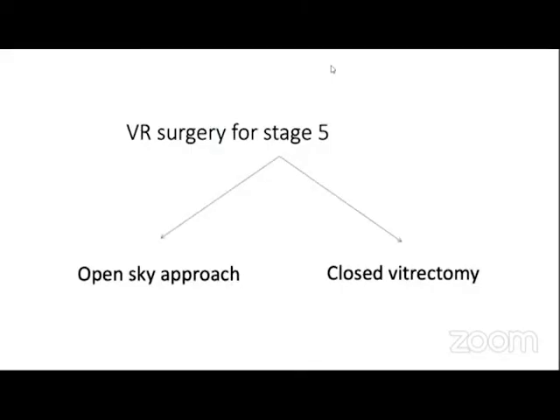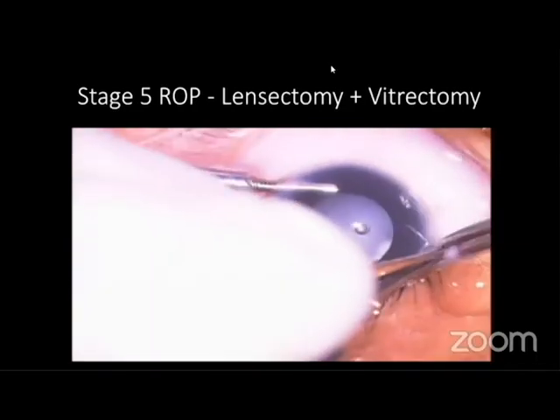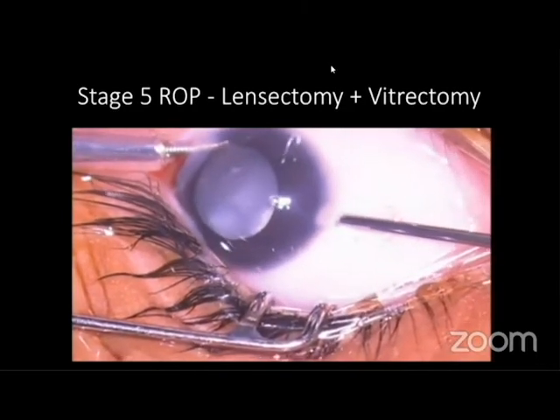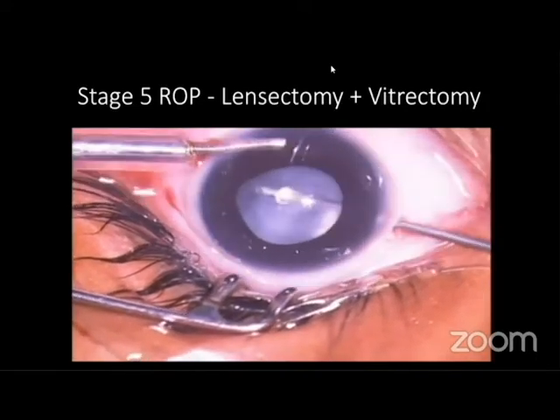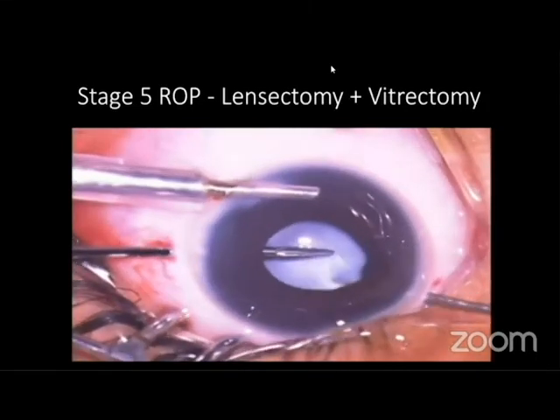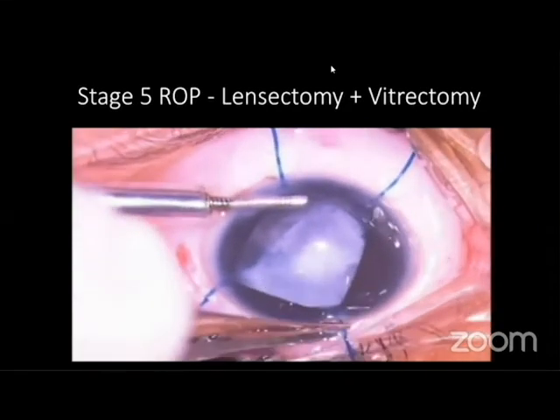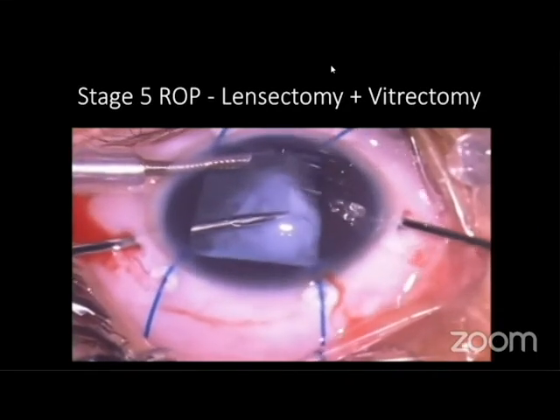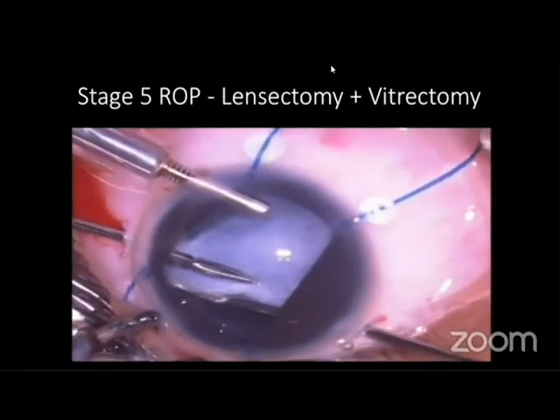So, moving on to stage 5 ROP. In earlier days, people used to do an open sky approach, and nowadays we most often do a closed vitrectomy. So this is one patient who is undergoing a vitrectomy for stage 5 ROP. The sclerotomies are placed about 0.5 millimeters from the root of the iris, and once a lensectomy is done, an anterior chamber maintainer is placed, and we go around and start dissection.